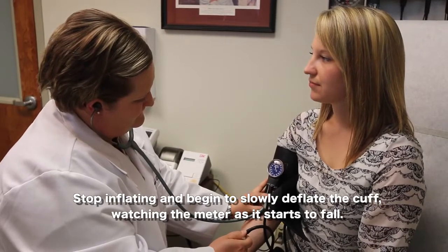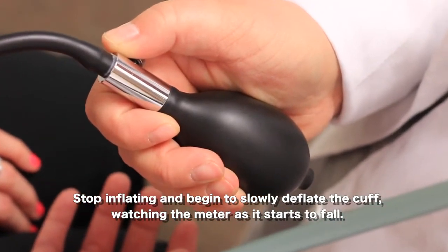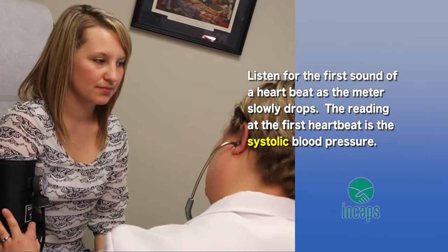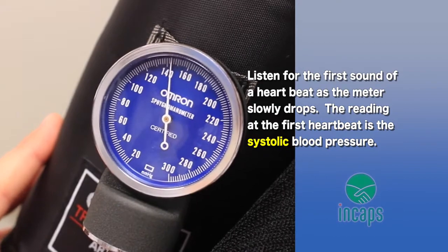As the cuff starts to come down, we release pressure from the bladder valve and listen through the stethoscope for certain sounds. The first measurement is when we start to hear a heartbeat again through the stethoscope — that will be our systolic blood pressure, which is the pressure in the blood vessels when the heart is pumping.